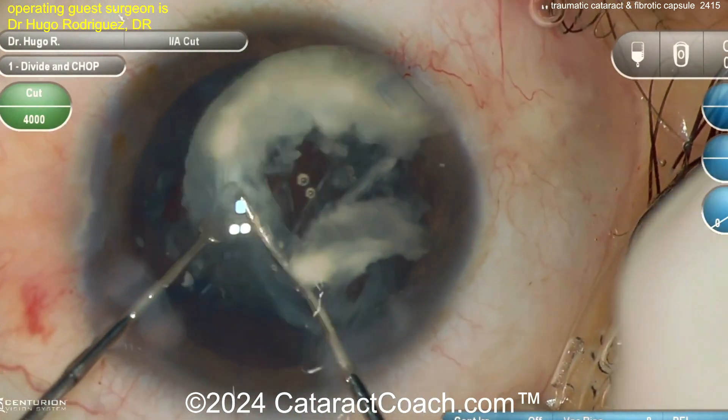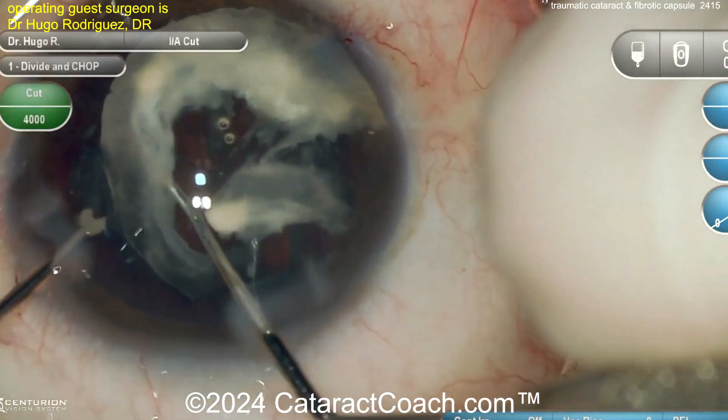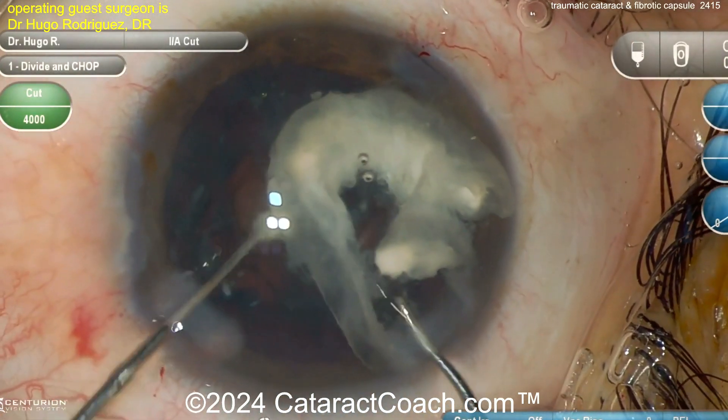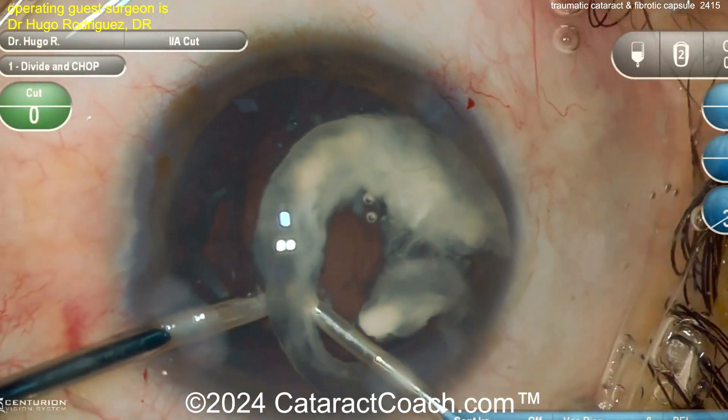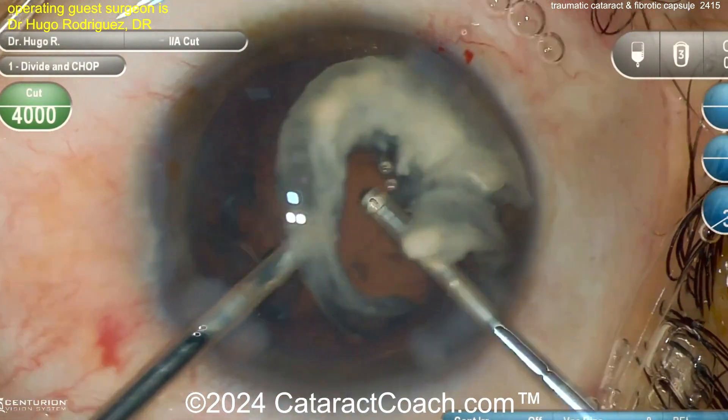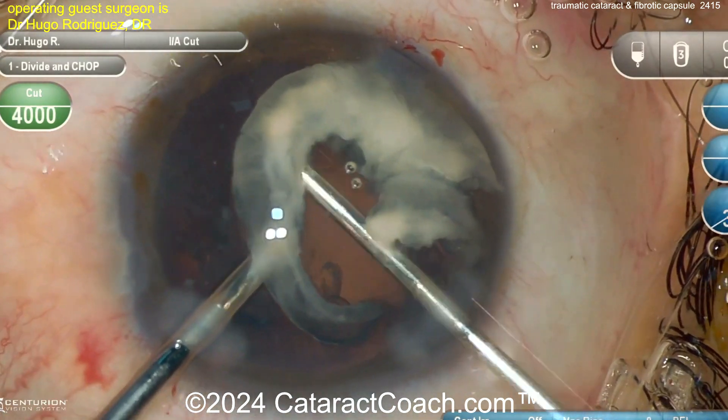This can become very hard and difficult to remove. Look at that — it's almost like a Soemmering's ring, but this is the peripheral lens area, the cortex probably, that has become very opacified.